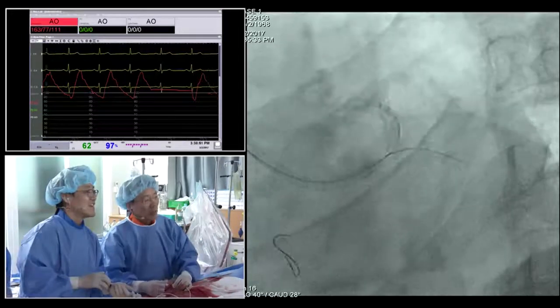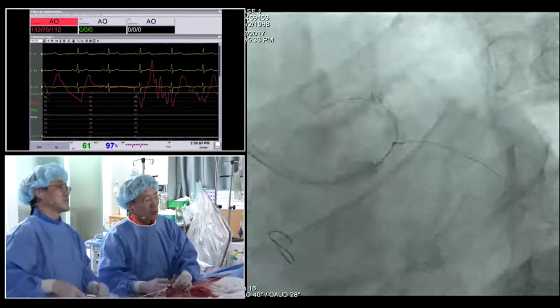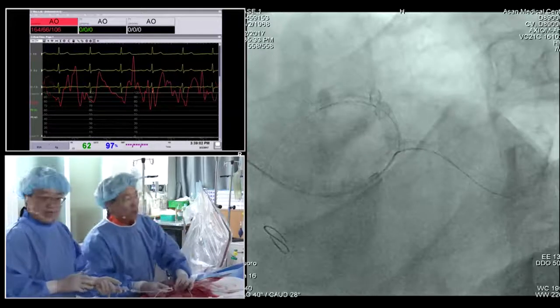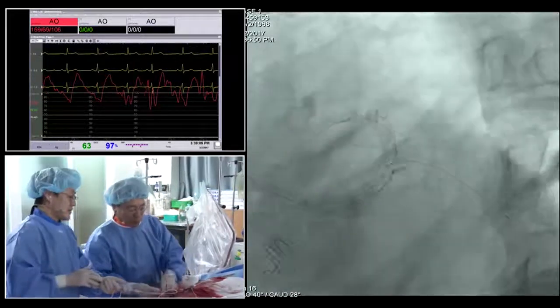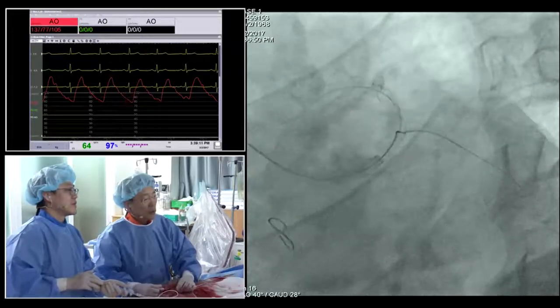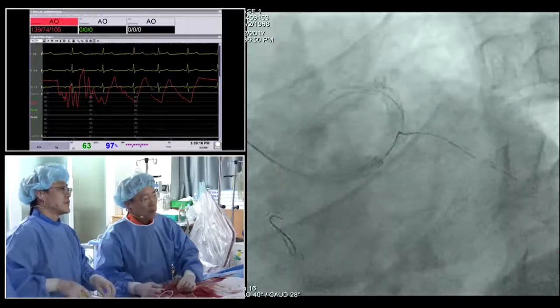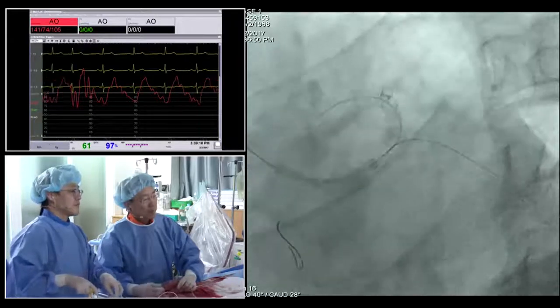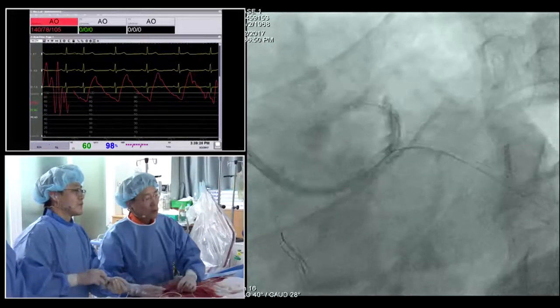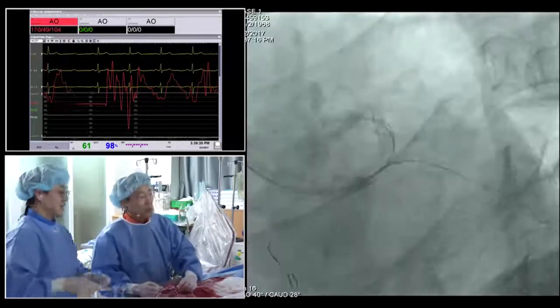However, the end portion looks like there is too much stent crushed area, and so we may need a very small balloon inflation first, and if it doesn't work, we're going to have some difficulty. Okay, still some struggling with the wire. The past area is good. It's the very proximal part. Okay, got it.